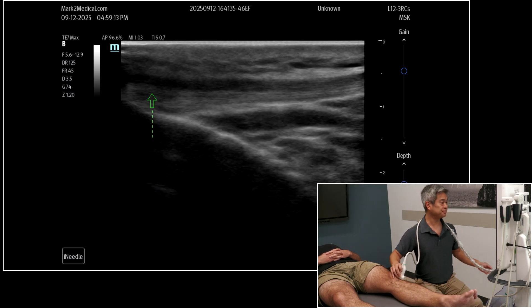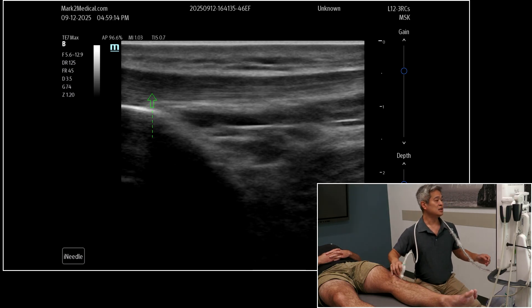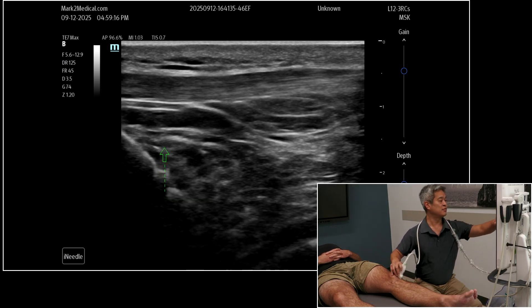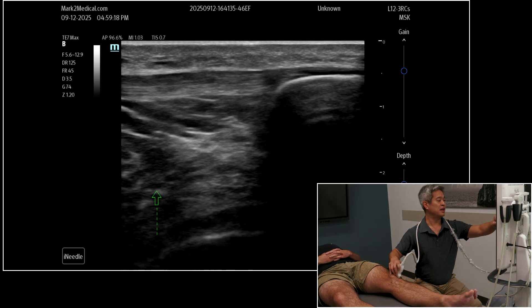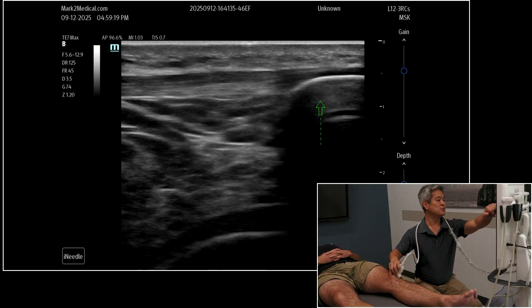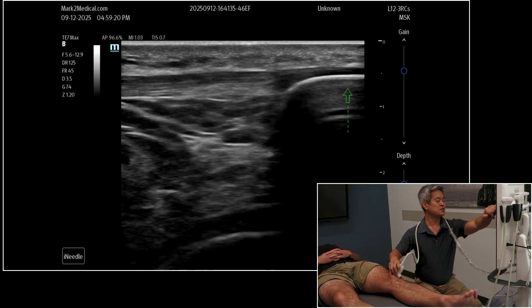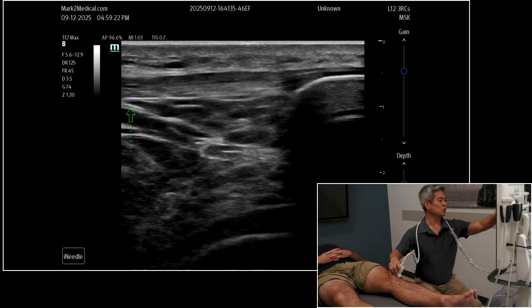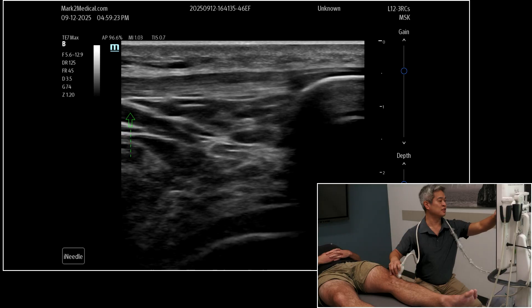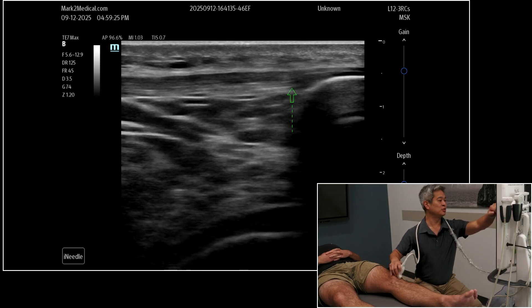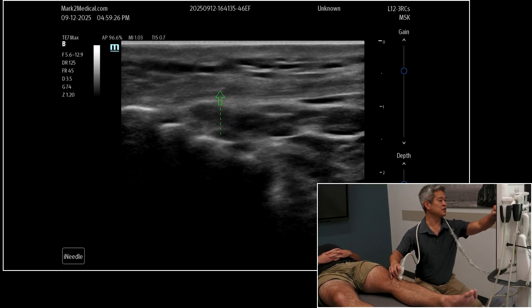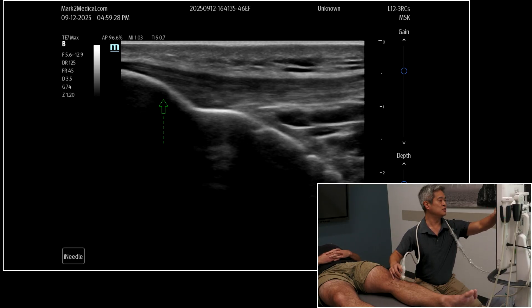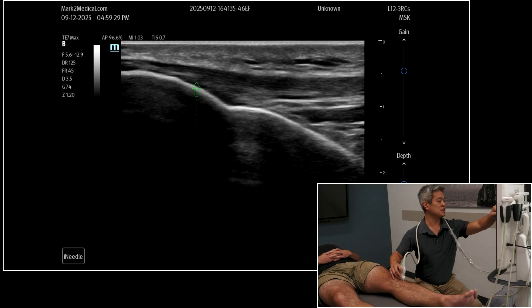So under ultrasound, here in the middle we have our patellar tendon. In this view, proximal or superior is to the right, distal or inferior is to the left. This is the inferior patellar pole — you can see the patellar tendon coming downward onto the tibial tuberosity here.